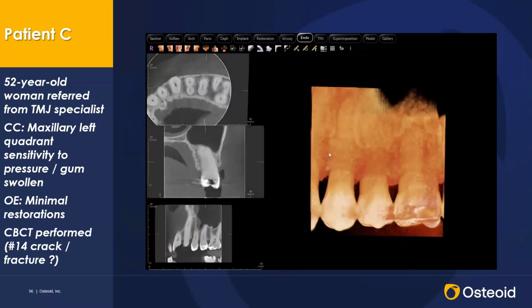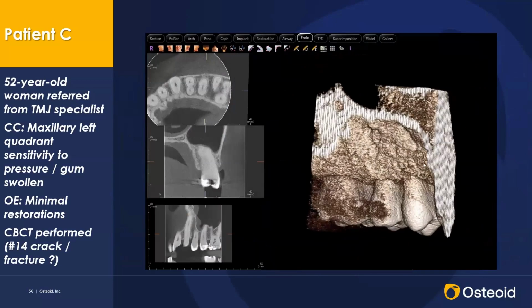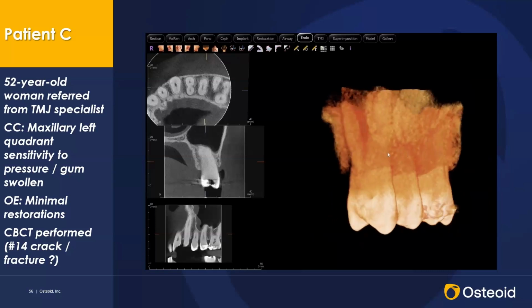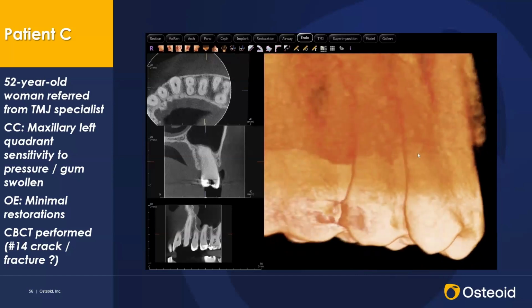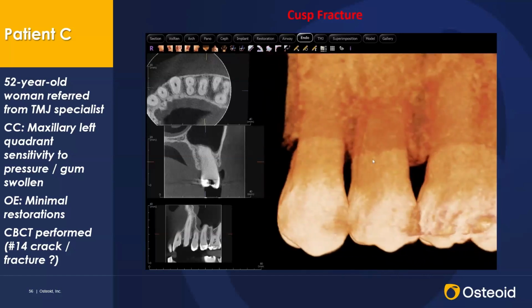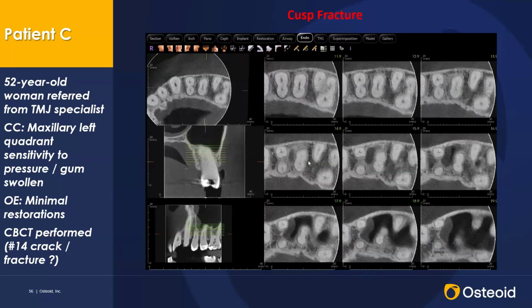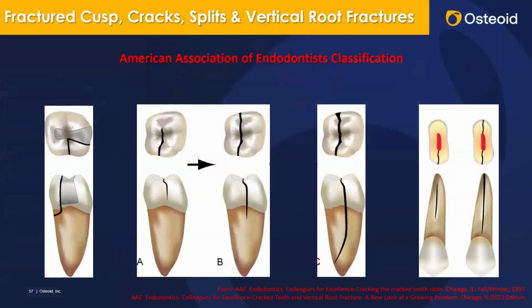We adjust it. We're going to create the visualization and sculpt it such that we can remove some of these aspects to be able to look at the tooth in 3D. And so if we spin this 3D around, we can immediately see on the palatal aspect of the first premolar what looks like to be a split of the palatal cusp all the way down. So we can then verify this and verify the extension of it using the residual components of the endo bounding box.